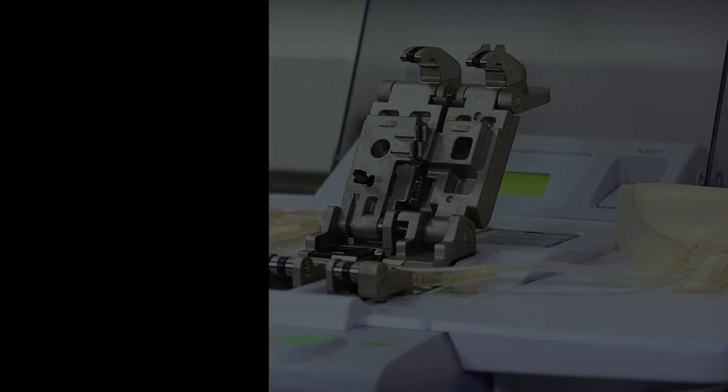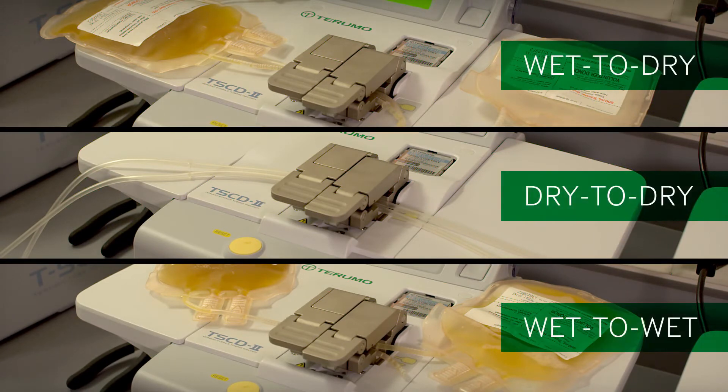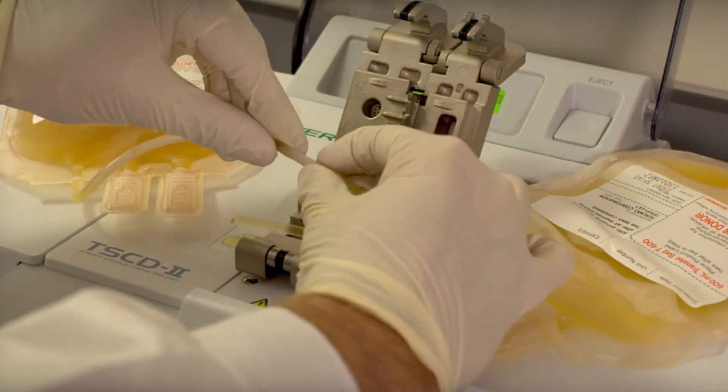Versatility. The TS-CD2 welder gives you the versatility to create a tubing seal that's wet to dry, dry to dry, or wet to wet without changing any settings. This single device can weld any combination of polyvinyl chloride tubing connections you need.